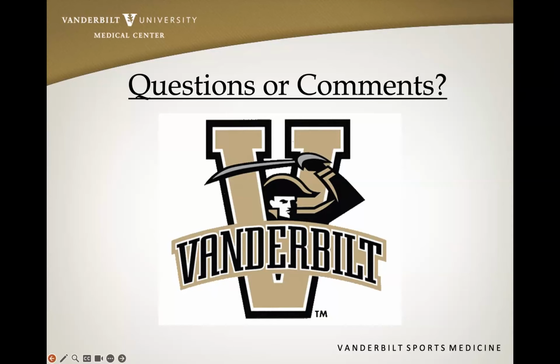The challenge for me is it's sometimes hard to get a good anchor on each end of the ligament because they don't tend to just be a straight ligament. They run in different orientations and cross over each other. I've definitely spent some time looking at those, but I don't know that I would say I'm an expert in those at this point. But yeah, there can be complex ligament injury patterns, lunotriquetral ligaments and things like that, that are being more recognized at this point from a pathology standpoint and a surgical standpoint, that maybe we need to catch up on with ultrasound.